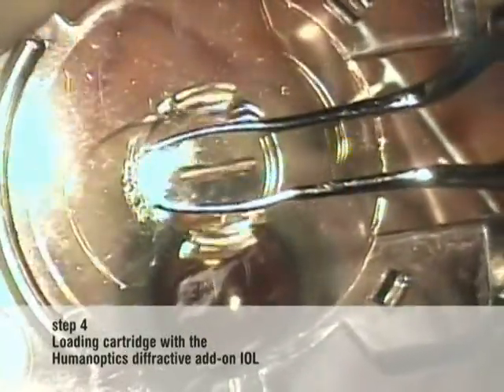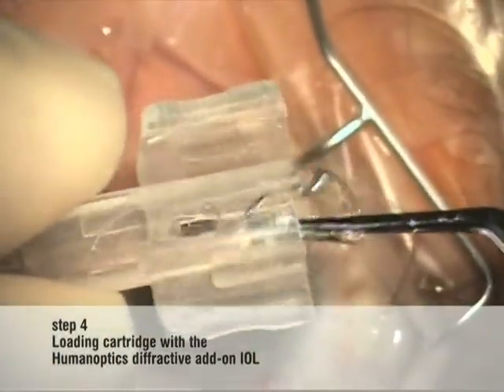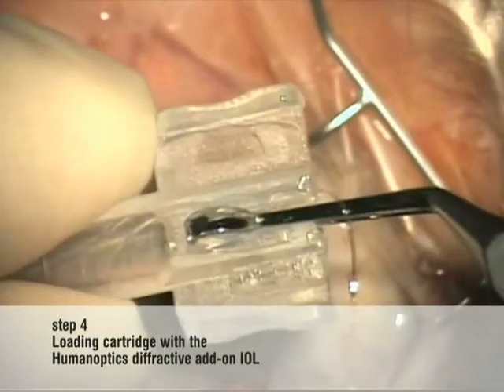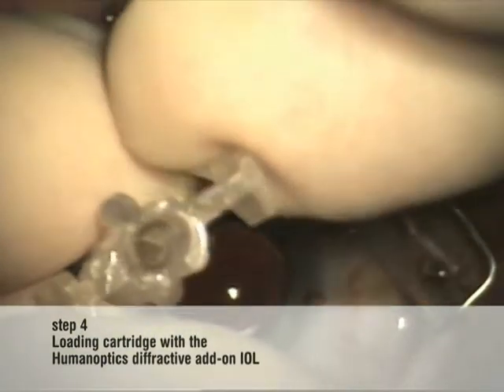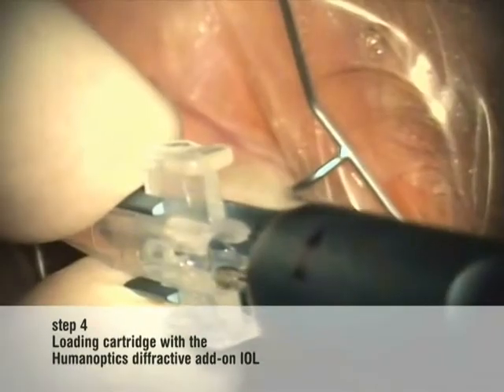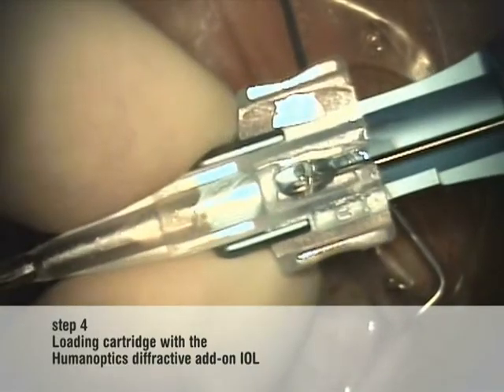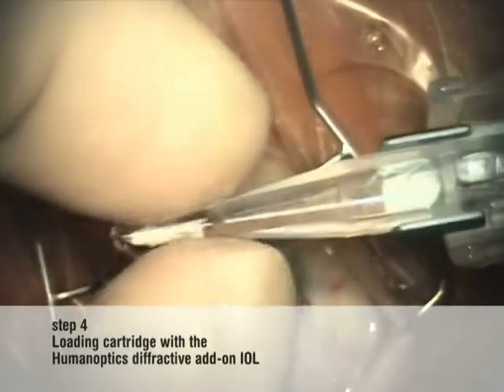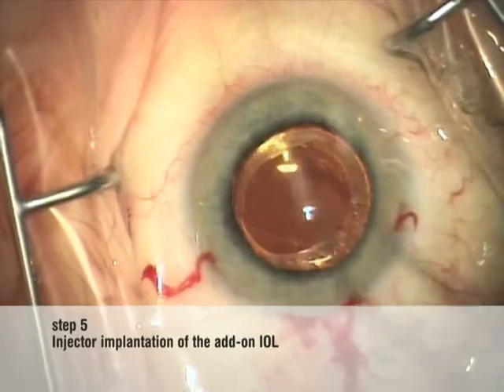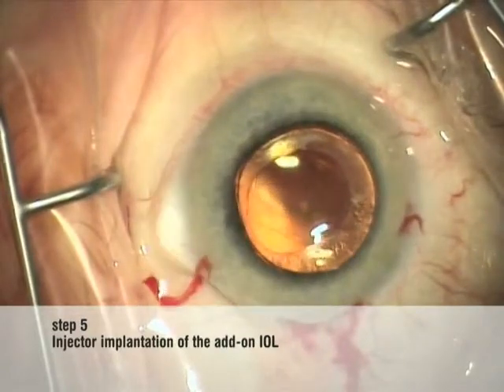The add-on is seized by F forceps and inserted into the cartridge without bending the long haptics. The add-on lies in the cartridge like a crescent. The stamp of the injector pushes the optic gently forward until the leading haptic can be seen in the front part of the cartridge. The tip of the cartridge is introduced entirely into the anterior chamber. Doctors used to implanting acrylic materials should remember that a silicone optic can unfold quite suddenly and therefore has to be pushed into the anterior chamber very smoothly.